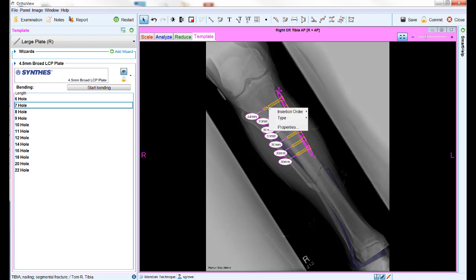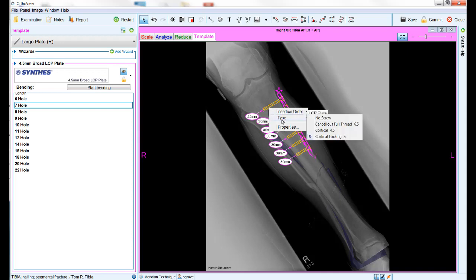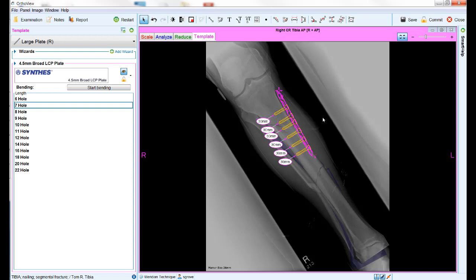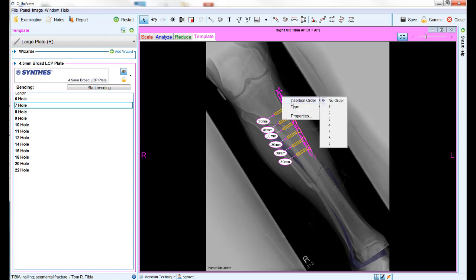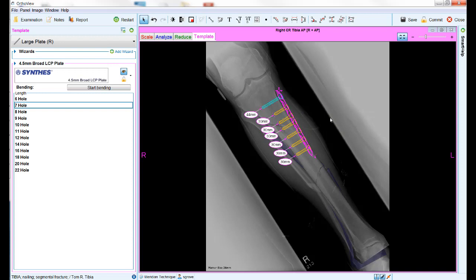Where possible, screws can be repositioned by left clicking and dragging anywhere in the main body of the screw. Right clicking on the screw body provides options for changing the screw type as determined by the manufacturer, as well as the option to remove the screw completely. If a screw is removed, a marker point remains which can be right clicked to access the menu and reinsert the screw if desired.